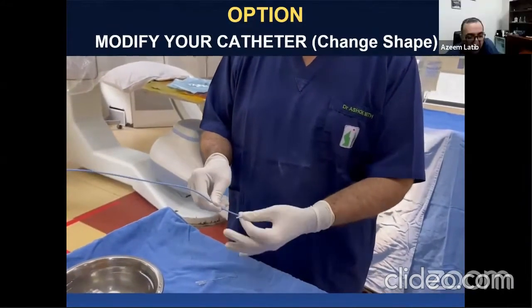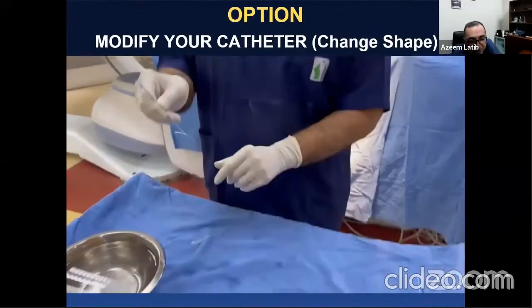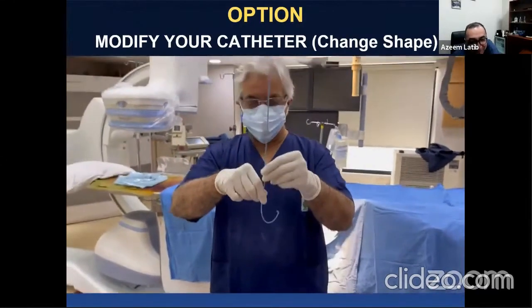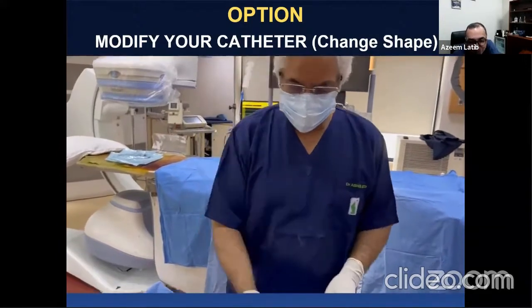Wow, Ashok, that's great. I remember Antonio teaching me how to shape catheters with a hairdryer. I haven't had to do it for a while, but I like this because you can't find a hairdryer in the cath lab anymore, but the hot water is right there.